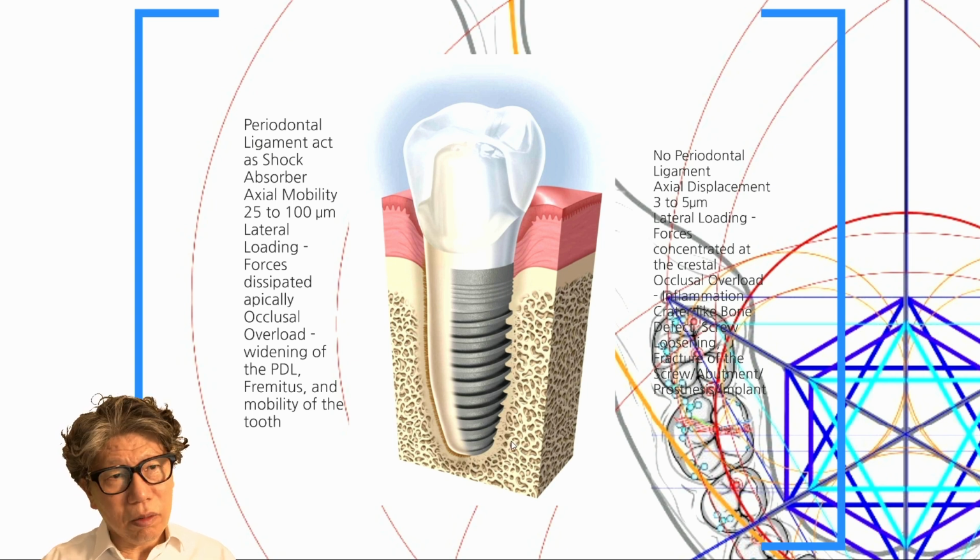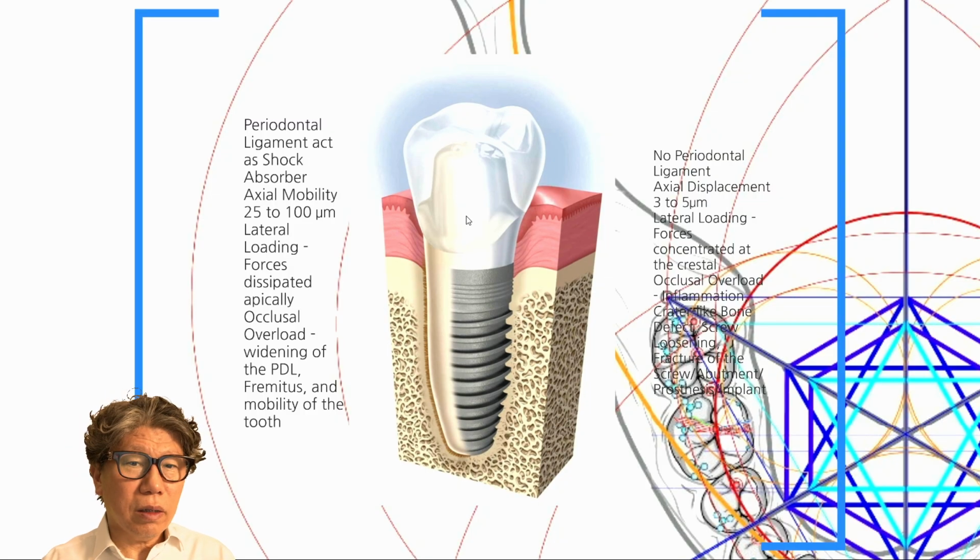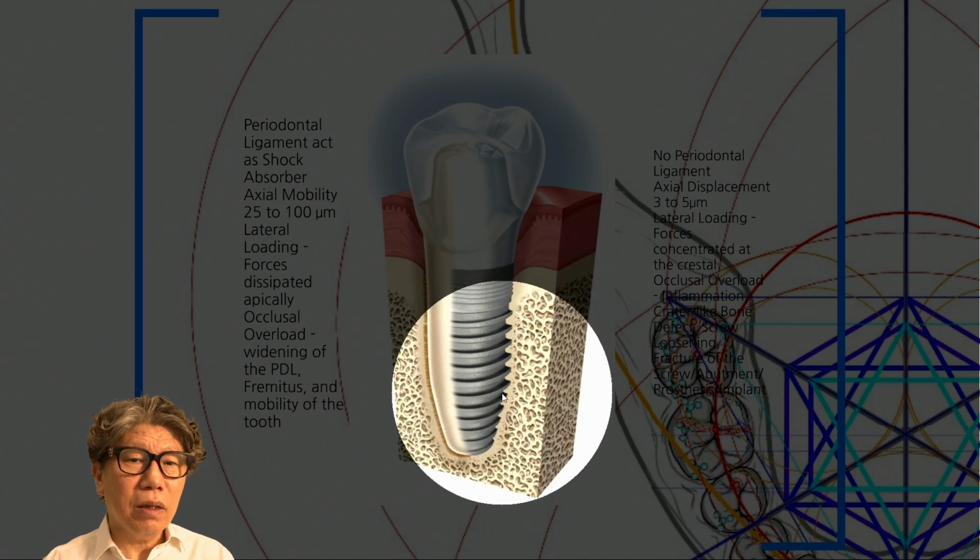Recently, pure titanium has been noted to break easily, so grade 5 ELI is used. It's referred to as 64 alloy. It contains 6% aluminum and then vanadium. Beryllium? Whether it's beryllium or vanadium, at any rate, we're using an alloy that contains about 4%, but aluminum is prone to rust. And vanadium is probably classified as a carcinogen. So it seems like there are not many companies making implants with 64 alloys anymore.